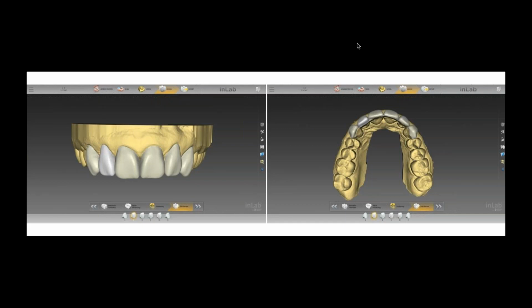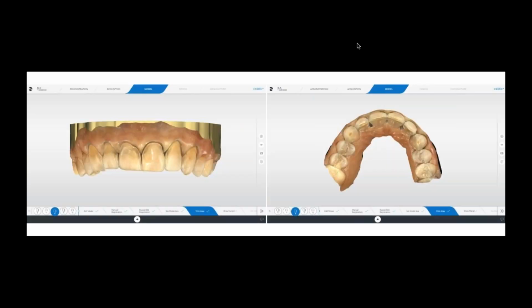So once we do the preparations, we go ahead and make the final scan. And you can see here the preps. We prep tooth 6 to 11. We use a double cord technique using a 000 cord first and a 00 cord second, which we will remove, dry, and then go ahead and make the intraoral scan.